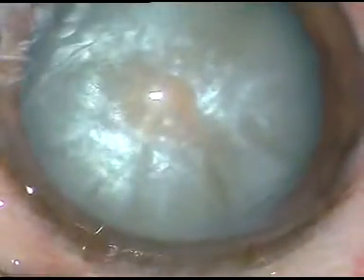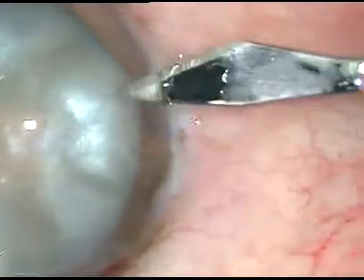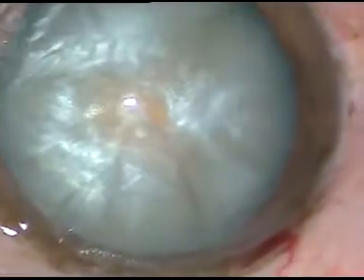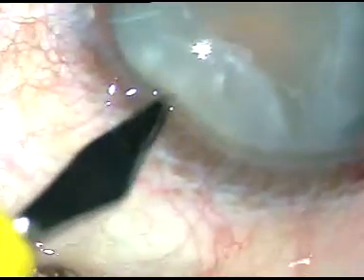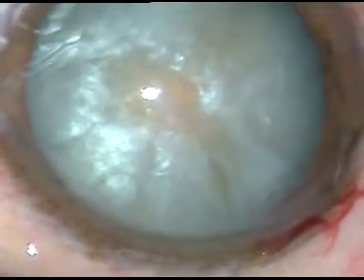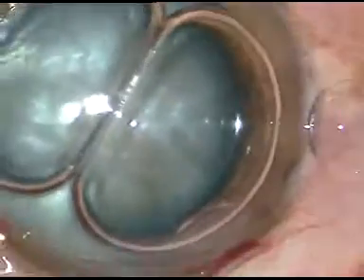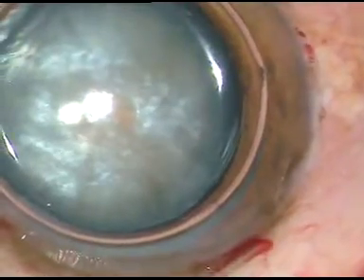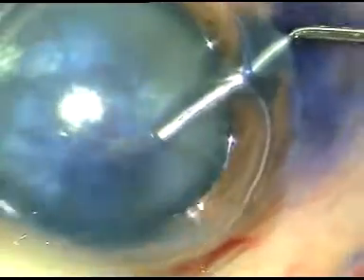And this is the third and final case. Main incision, side port incision, and another side port incision — all incisions have been made without injecting any viscoelastic substance. Now trypan blue dye is injected.